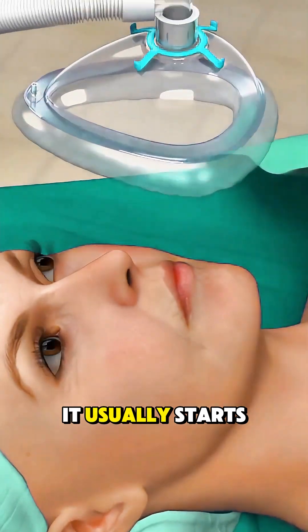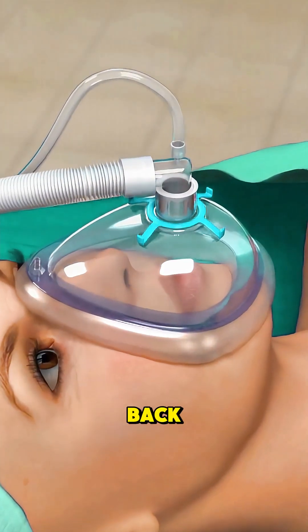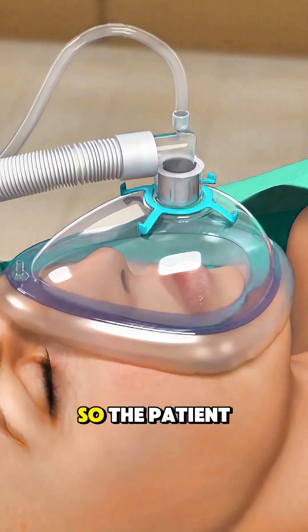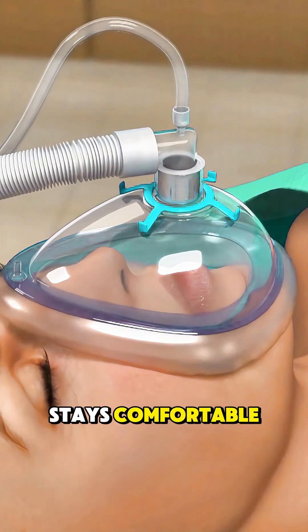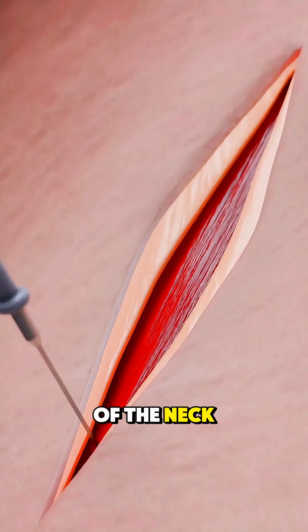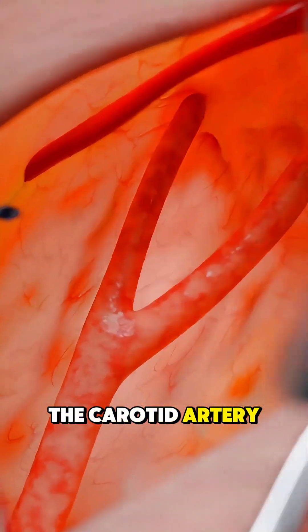It usually starts with the patient lying on their back under general anesthesia so the patient stays comfortable. The surgeon then makes a small incision along the side of the neck to gently reach the carotid artery.